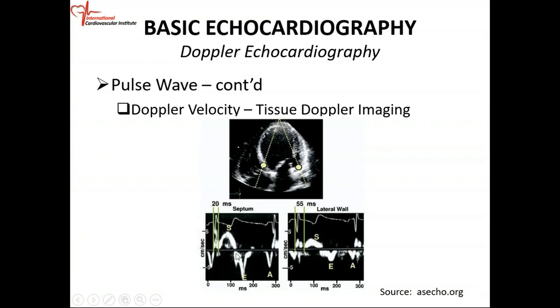The S-prime tells you that your medial mitral annulus is moving upwards towards the transducer. Then in diastole, it moves downward and you have two diastolic components — your E-prime first and then your A-prime. Your ECG is on top. In systole it moves upwards — that's why it's above the baseline. Systole is from the onset of the QRS to the end of the T wave; diastole is from the end of the T wave to the QRS.